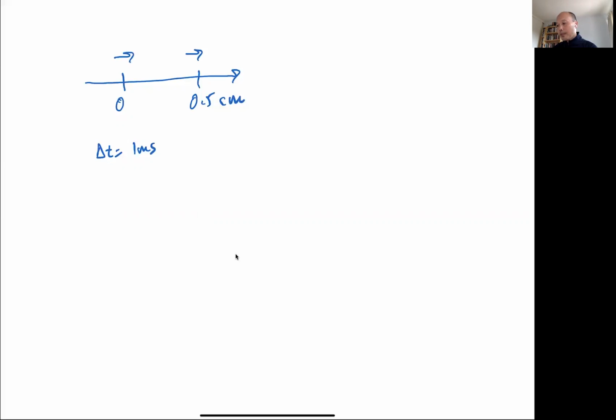And so you're given some choices there. One way to think about this is if I'm only looking at these spins once every millisecond, then this spin here at isocenter always stays at phase of 0. So that's not going to change, and all I really care about is this spin here. If it returns back to its original position every millisecond, then we won't be able to tell that spin apart from the spin at 0.